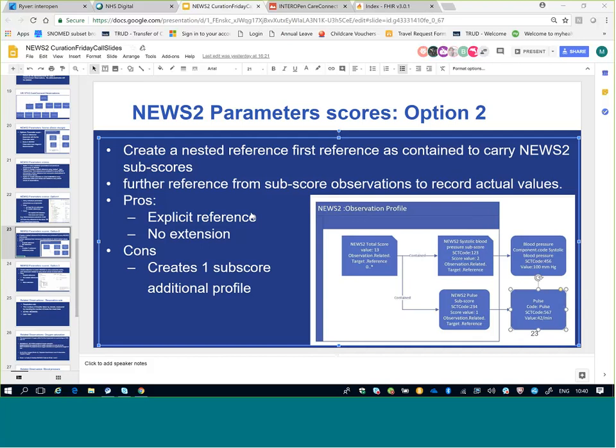Yeah, I mean, so I think the observation has got a comment field anyway, so I think that could be used, but we haven't actively recommended it. But we could, I think we should in our implementation guidance, say use the comment field to carry any kind of further actions or any note you want to send. I think that would make sense. Otherwise, what you risk is losing data along the way, but the system that generated it has told you what should happen, what the escalation process should be, but the receiving system doesn't receive that. Yeah, I think that's important, thanks.